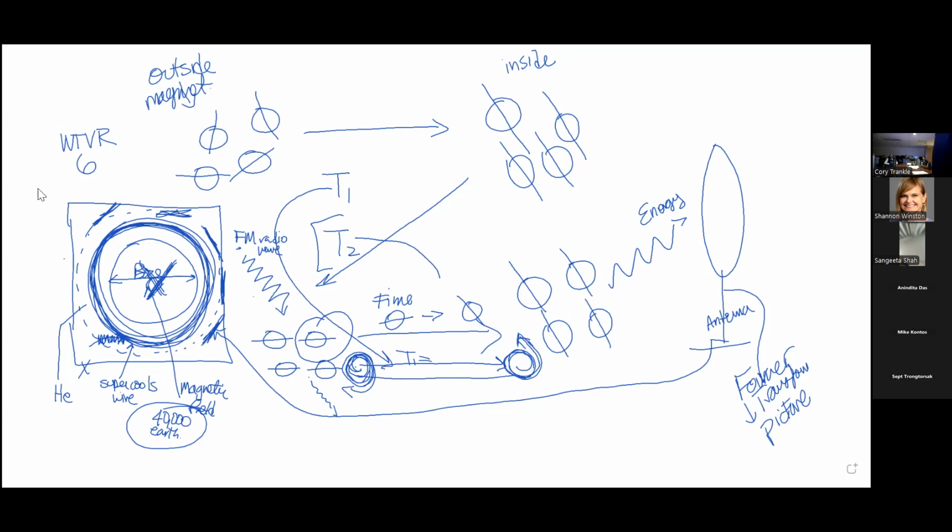And the unwinding time, if we have these different field strengths, remember we wrap this thing with copper wire, right? And we have basically 1.5 Tesla, and we have 3.0 Tesla, okay? So that's the strength of the magnetic field, all right? For 1.5 Tesla, what does that strength do?